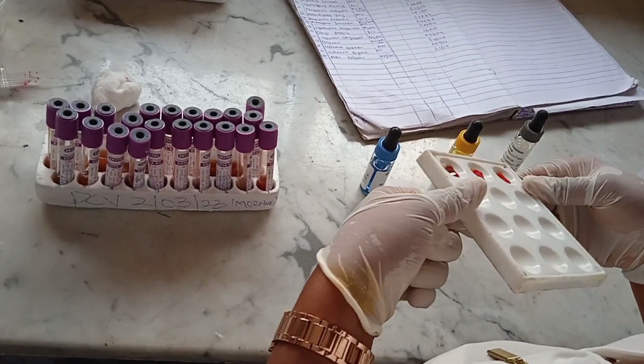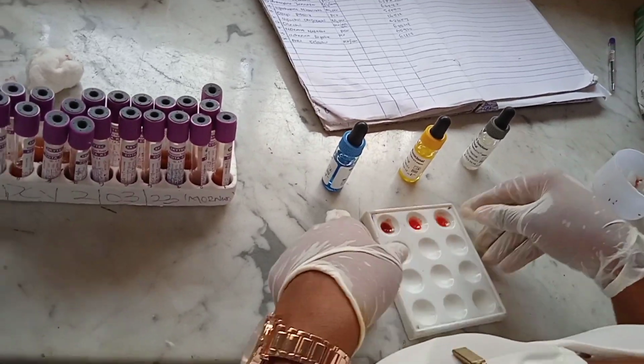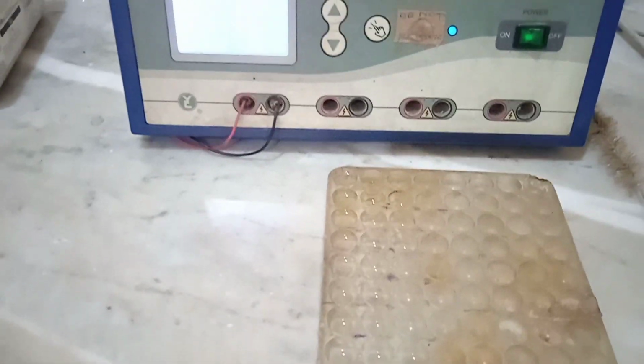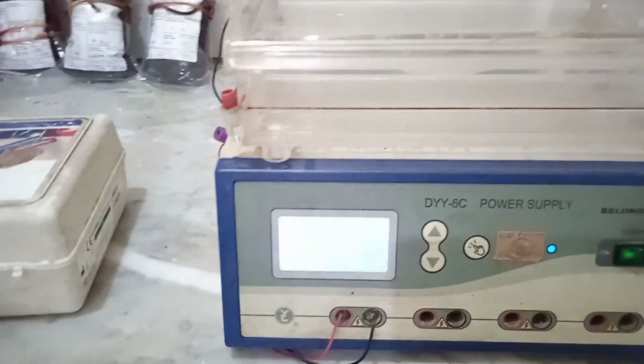So this is basically how blood grouping is done. And this is also the electrophoresis machine used in doing genotyping. We are basically just running the test here where the blood has to separate and all of that. It's a whole detailed procedure actually.